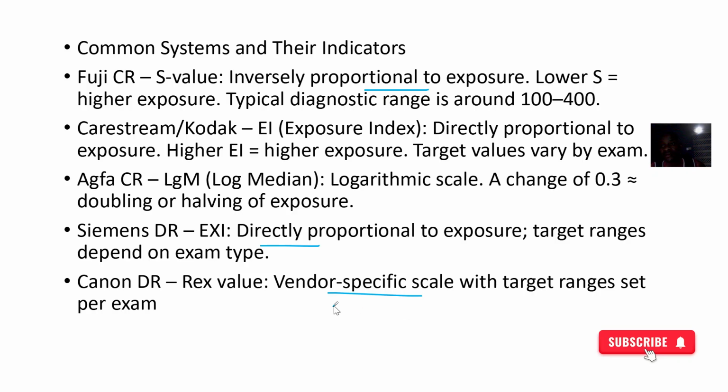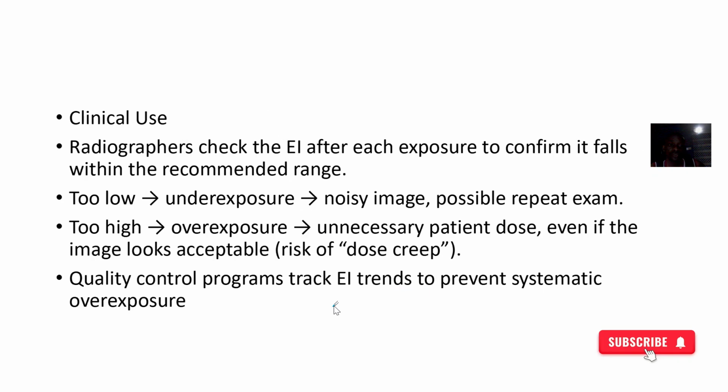set per exam. So clinical uses: radiographers check the EI after each exposure to confirm it falls within the recommended range. You understand? They always check it.